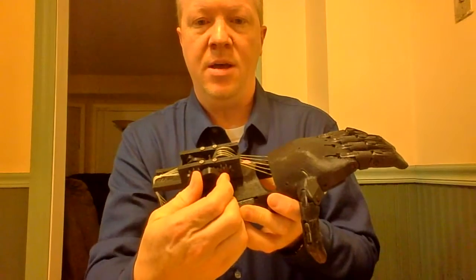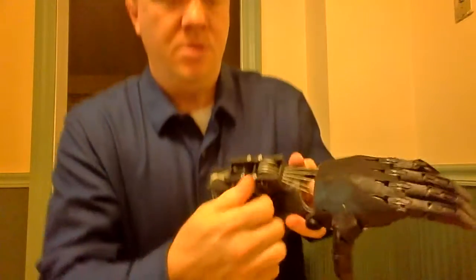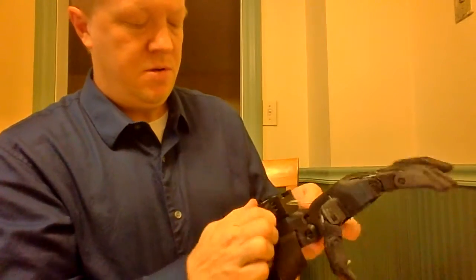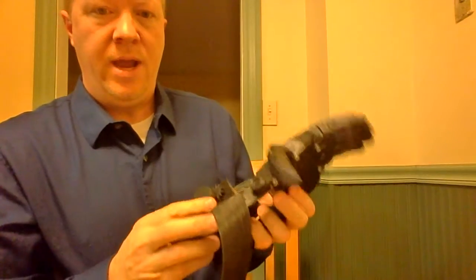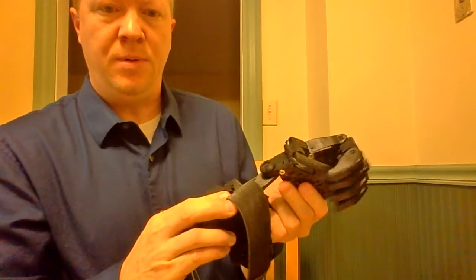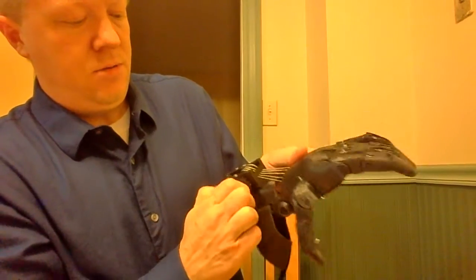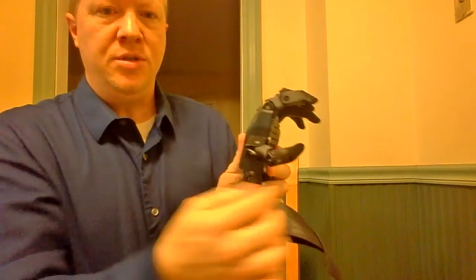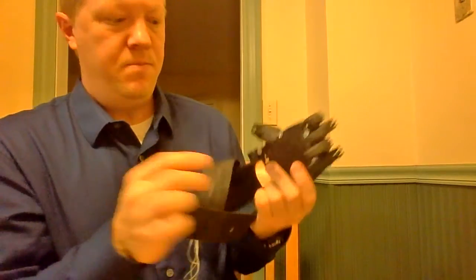So what happens now is as I rotate these two gears, I can pick the different positions. And I'll set it, for instance, if I set it right here, I get a full grasp. If I then rotate it to the next position, this is the cup position where the little finger comes in further to hold the cup.